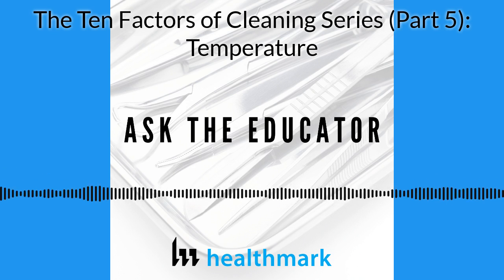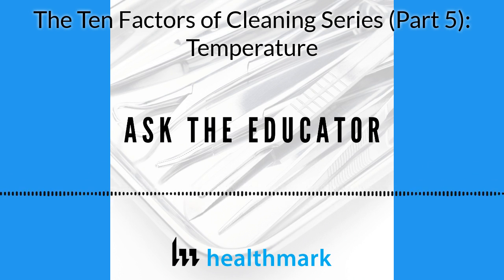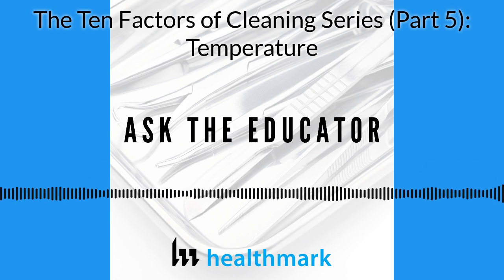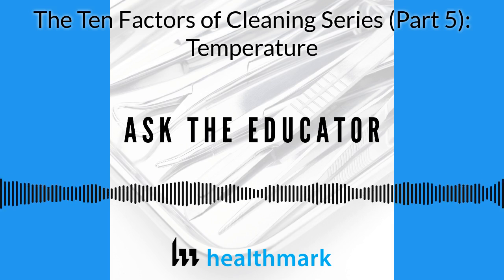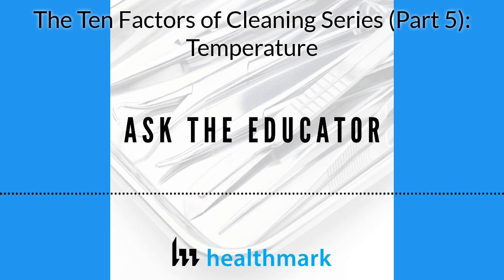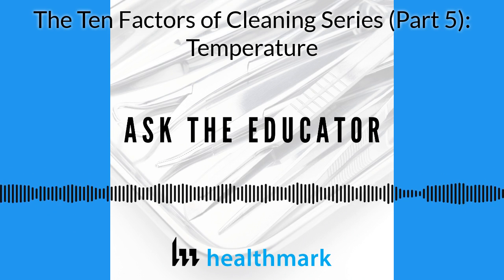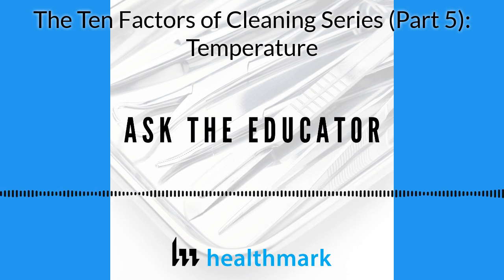Yeah, I think so. And I'm glad that you brought up the different stages and where we should be monitoring the temperatures. One of the things that I remember learning early on when I converted over to SPD was learning about how enzymatics required a certain temperature range to work effectively. And I thought, being the smart manager that I am, I'm going to do something that's going to make my life easier and the techs' easier. And we switched over to a surfactant-based detergent, which is great.